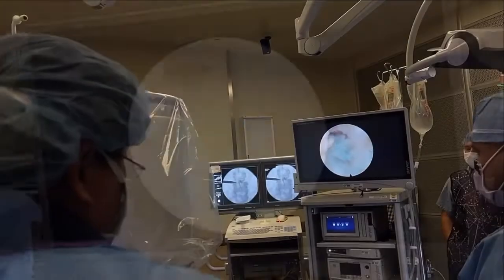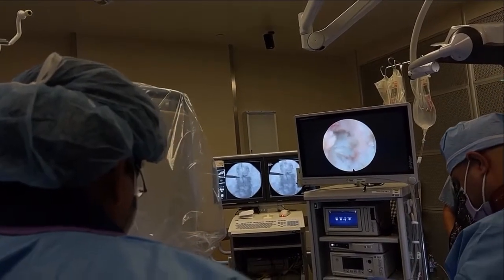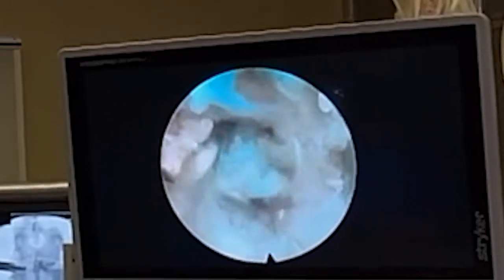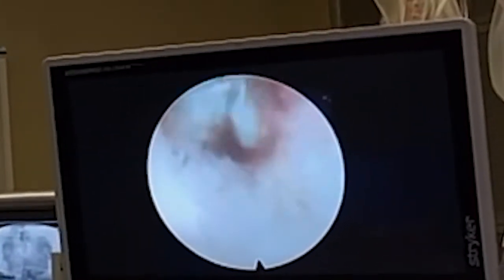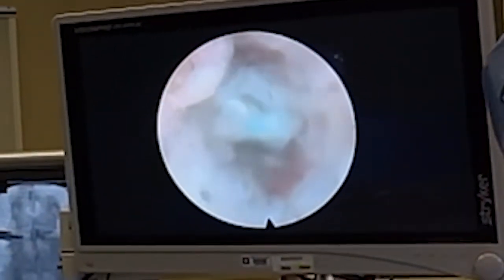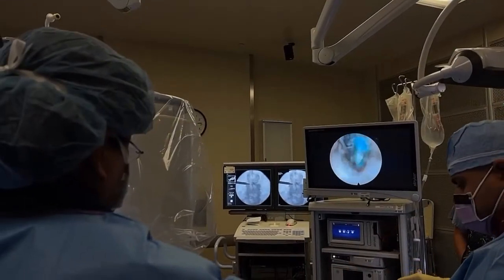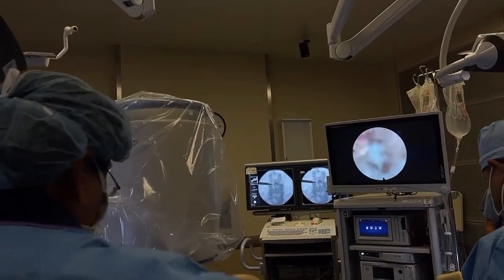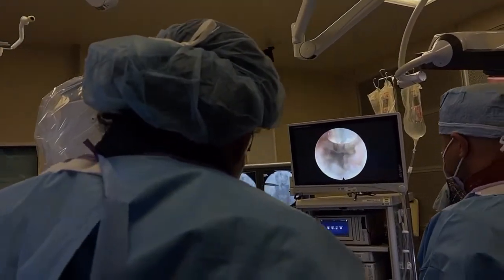The Mikey fragment, as this is called. The last fragment, right before I get done. It's like a punk teenage kid. There's something right there, huh? But it's not going to come out without a fight. Almost. X-ray? And it's exactly right in the middle.